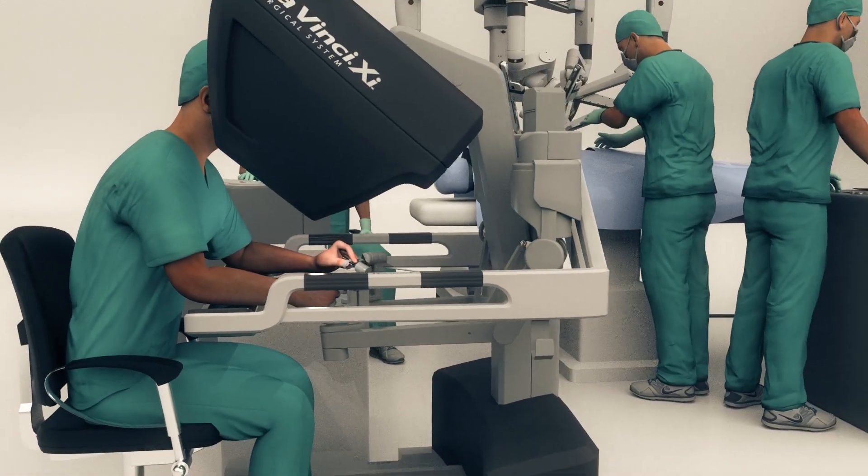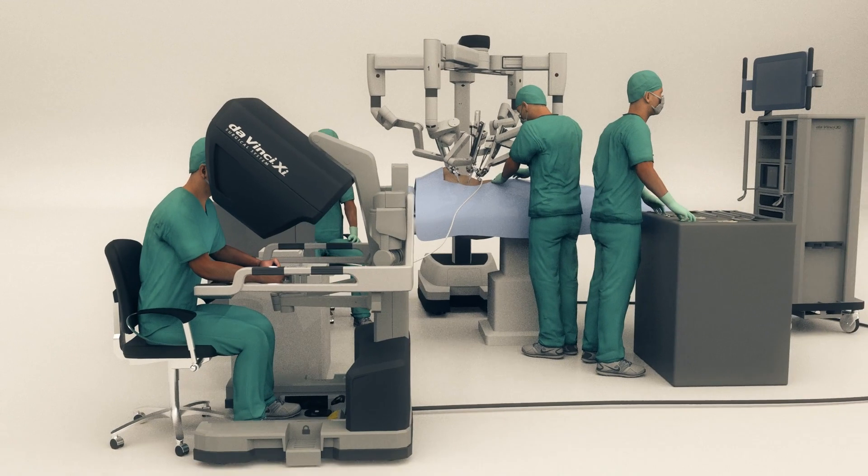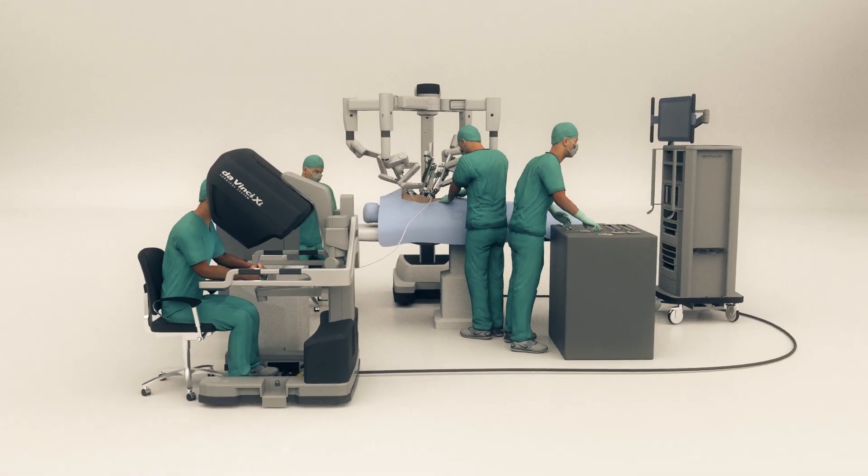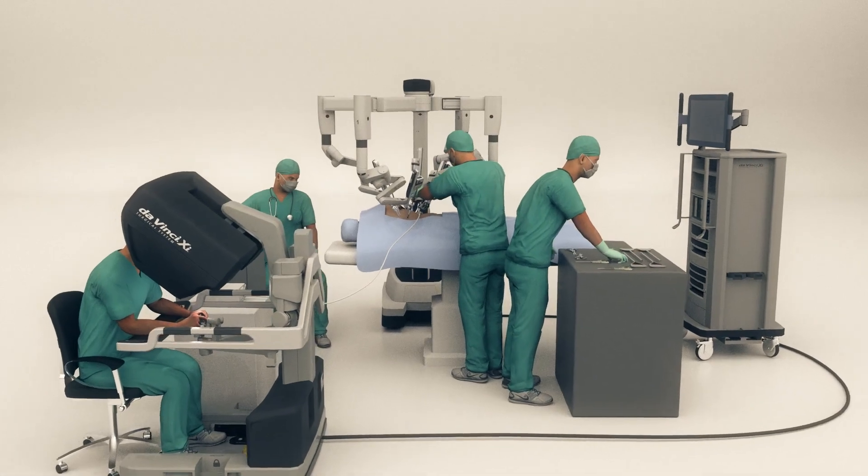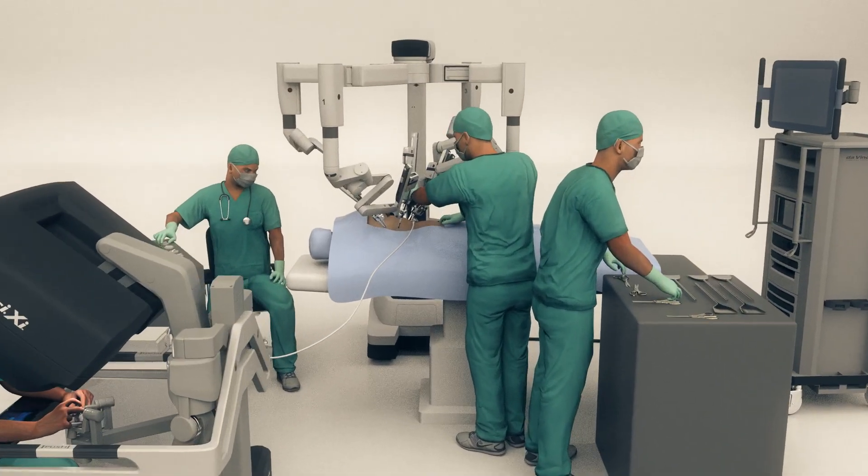A robotic lobectomy is a technological advancement for the treatment of lung cancer and other diseases requiring lung resection. A lobectomy involves the complete removal of one of the lobes of the lung.